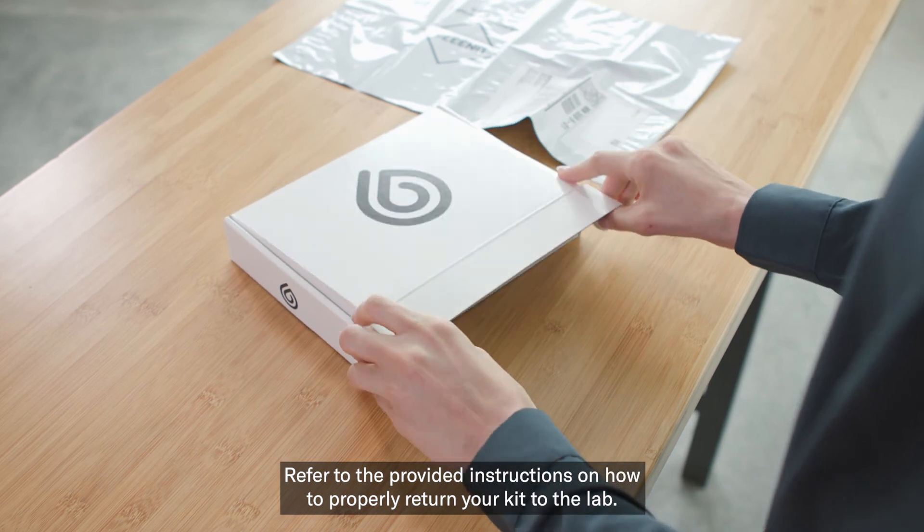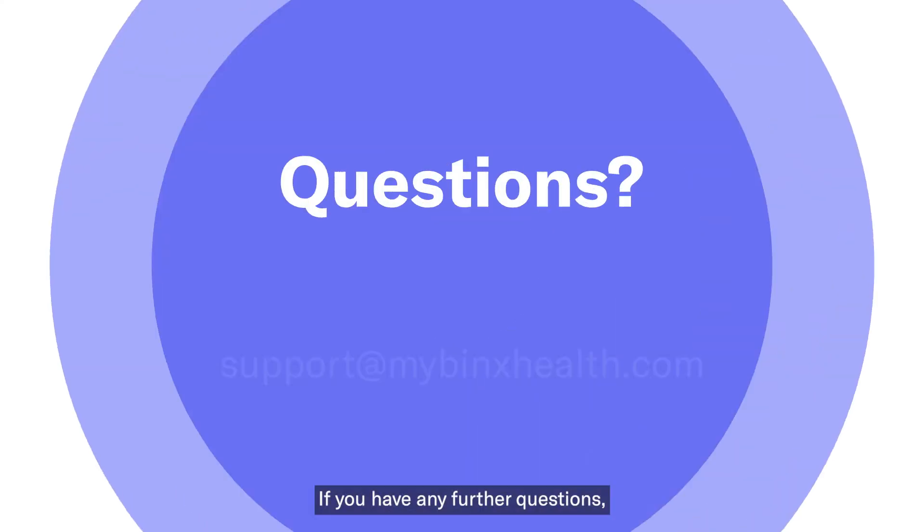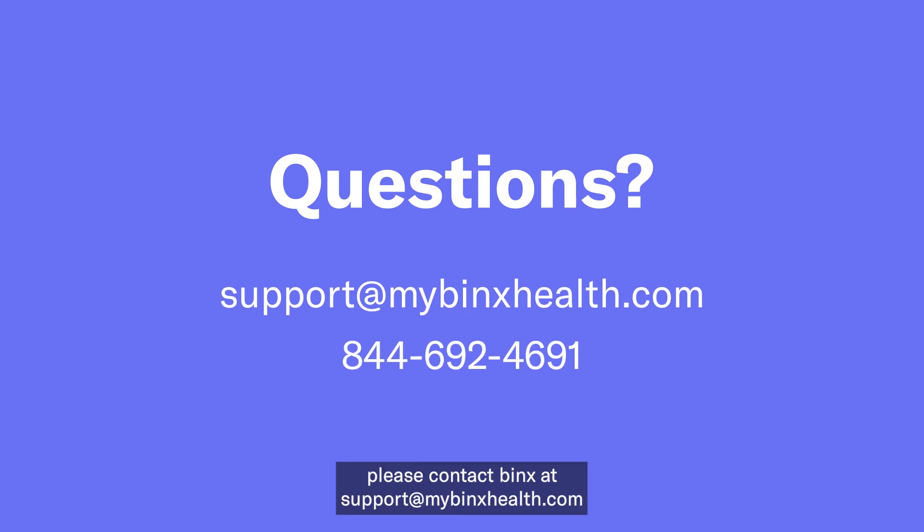Refer to the provided instructions on how to properly return your kit to the lab. If you have any further questions, please contact binx health at support@mybinxhealth.com or call 844-692-4691. Thank you for using binx health.